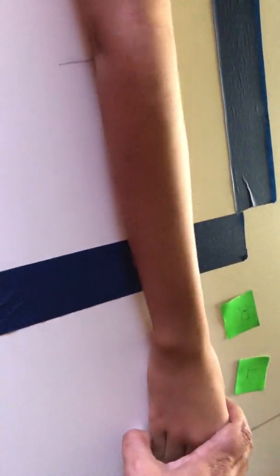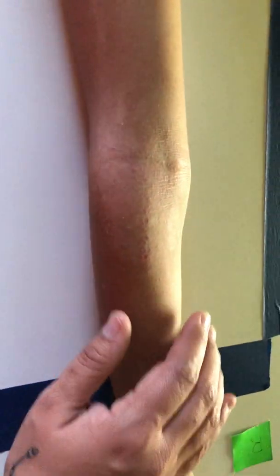Then next is the medial oblique. The patient will have their arm extended as such, and then pronate. It's kind of hard to show because it's a flat surface right here, but they would pronate their hand. The central ray goes through the middle of the elbow at a 45 degree angle, perpendicular to the center of the elbow joint through the center of the film space. The anatomy we are trying to see is the oblique projection of the elbow joint, distal humerus, and the proximal forearm. The coronoid process of the ulna is demonstrated as well. I threw this in there again because it's the right arm.